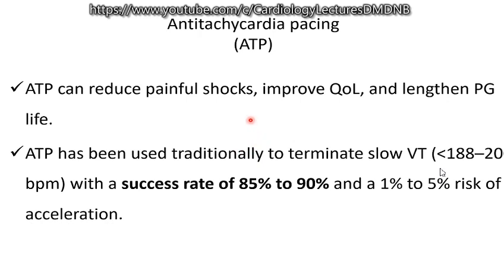So how do we decrease the number of shocks? By utilizing ATP extensively, overdrive pacing. They are painless. Mostly patients are not aware. Few patients can feel ATP also. They improve the quality of life and then they can lengthen the battery life.